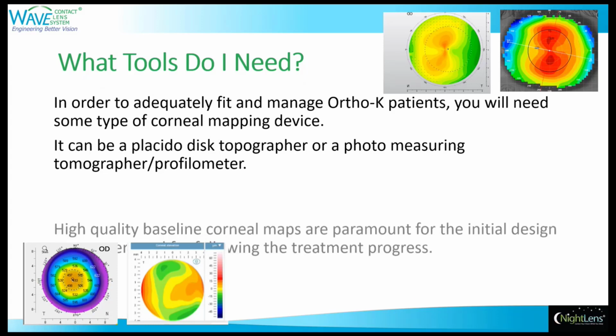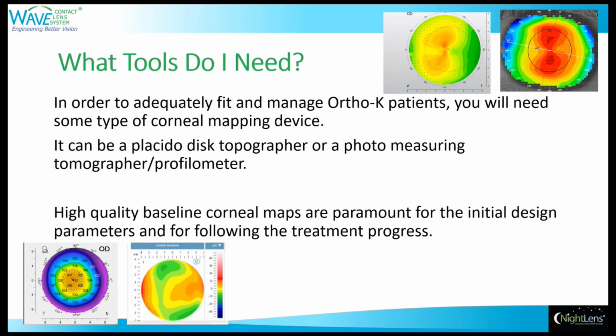In any event, whatever baseline maps that you're taking, they must be of high quality, because the higher the quality, the better result that you will have, whatever type of modality that you're using for offering Ortho K patients or designing Ortho K lenses.